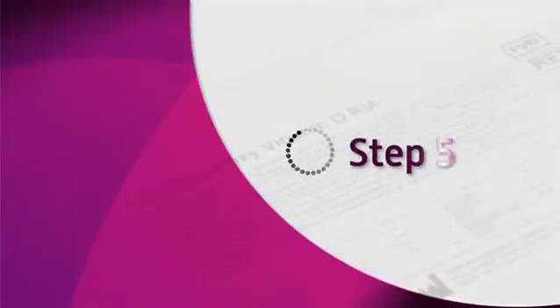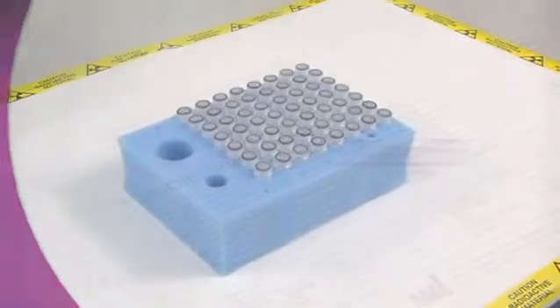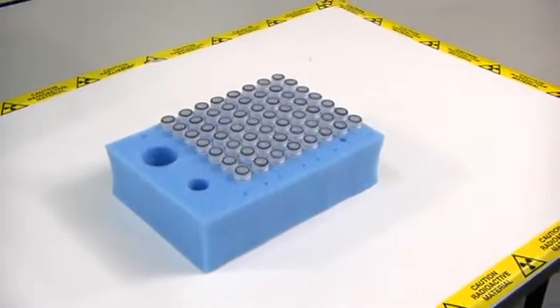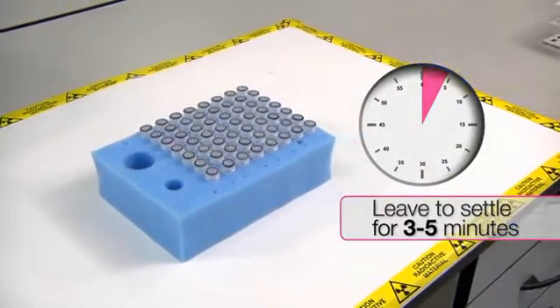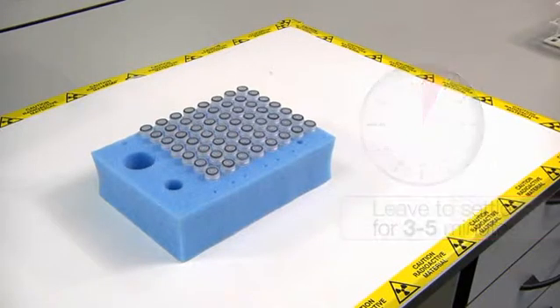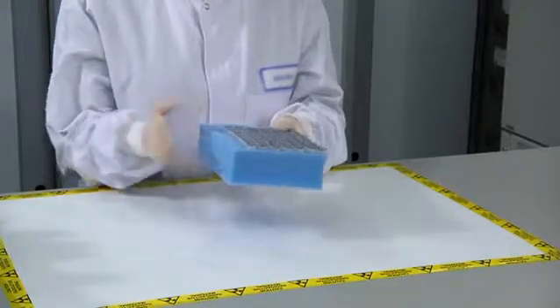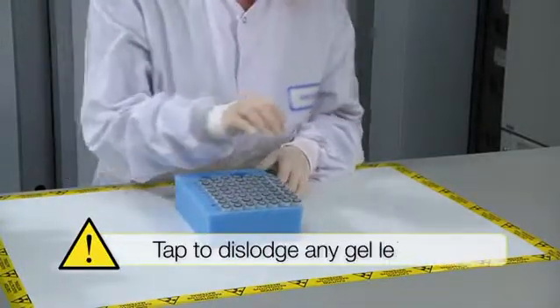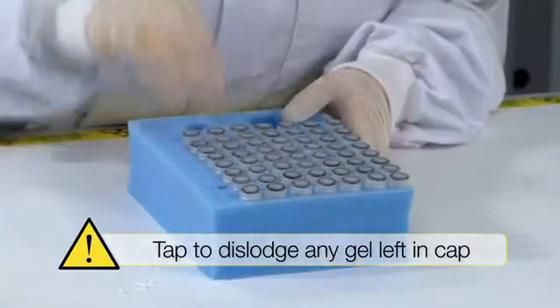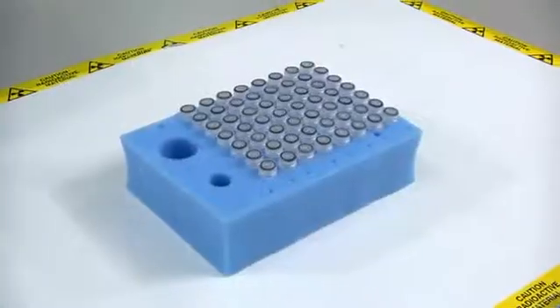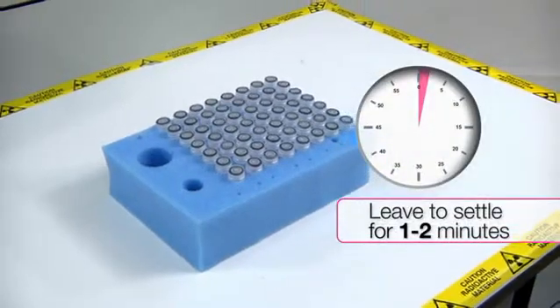Step 5: Stand immunocapsules upright in foam rack for 3 to 5 minutes to allow gel to settle. Tap to dislodge any gel adhering to the screw caps. Allow gel to settle for a further 1 to 2 minutes.